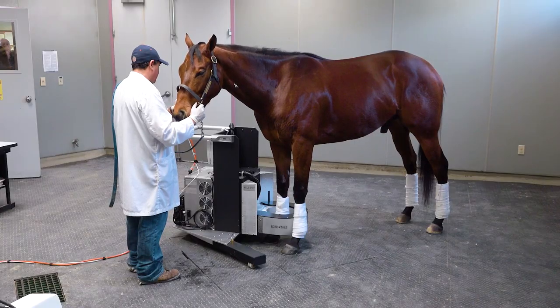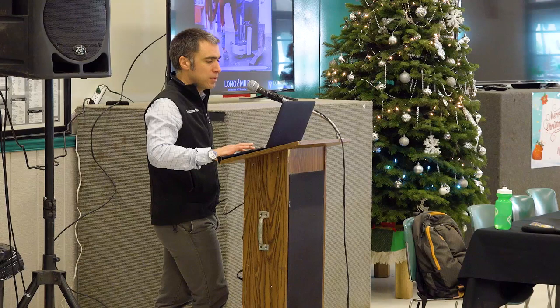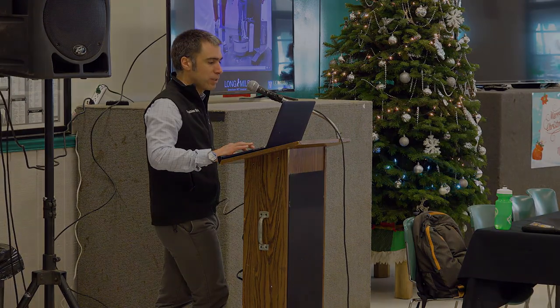To illustrate how this works — this is a horse being imaged with the fetlock in the scanner. The concept is that if the horse were to move, you can see the scanner opening up freely, which makes this a much safer approach for standing sedation imaging.